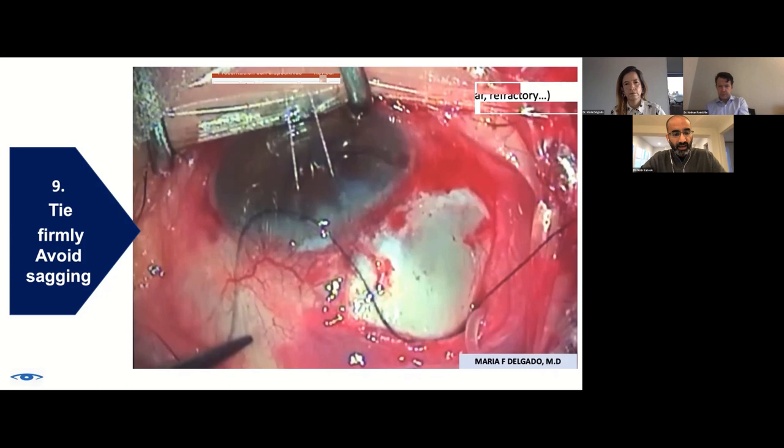And Friedman from Duke actually has an algorithm where she can type in the axial length and the plate, and she'll show you exactly how far from the limbus you can go. And she does a lot of pediatric surgery. So that was the reason for it with the shorter eyes. Really important point that maybe doesn't get as much airtime, but where you put it from the limbus is extremely important.